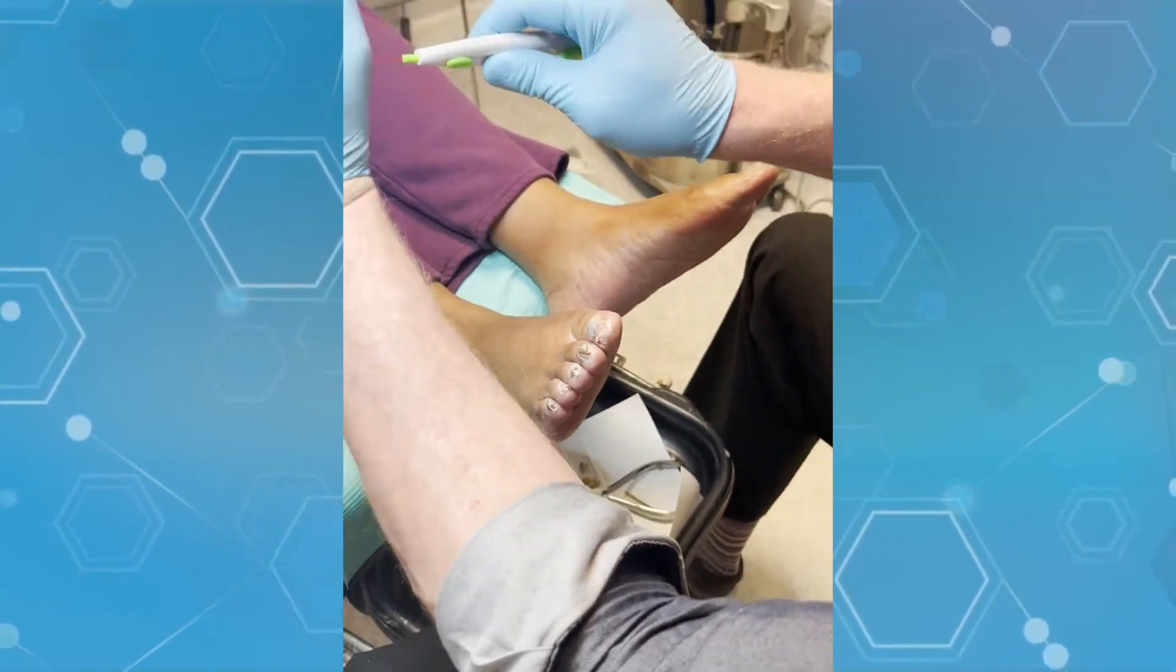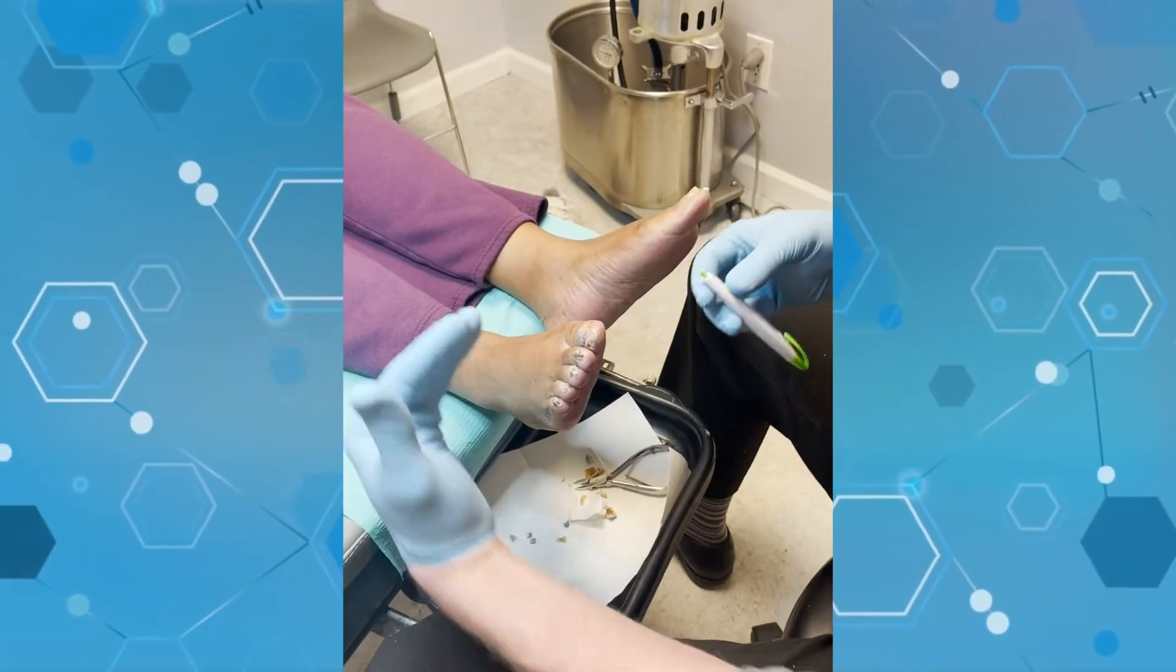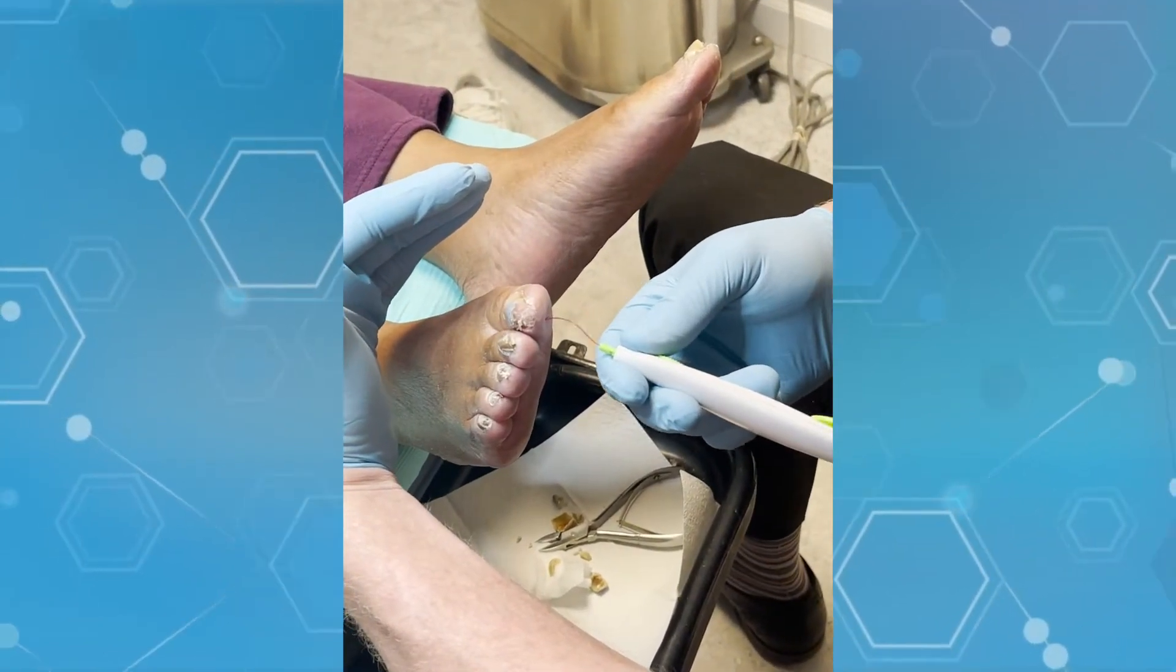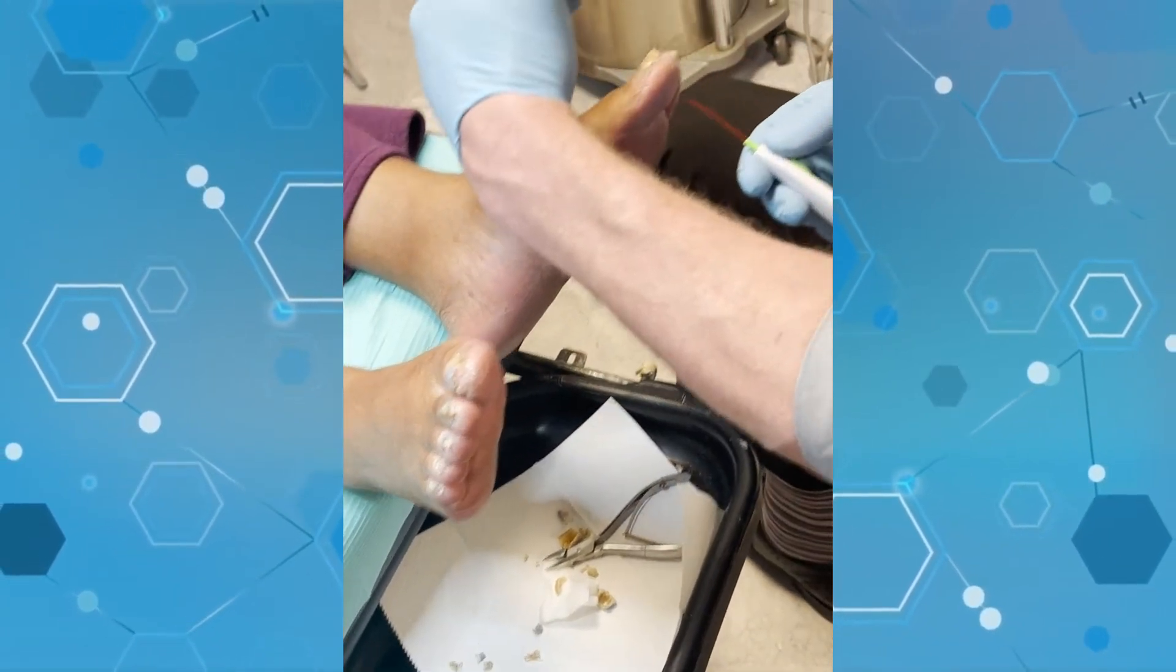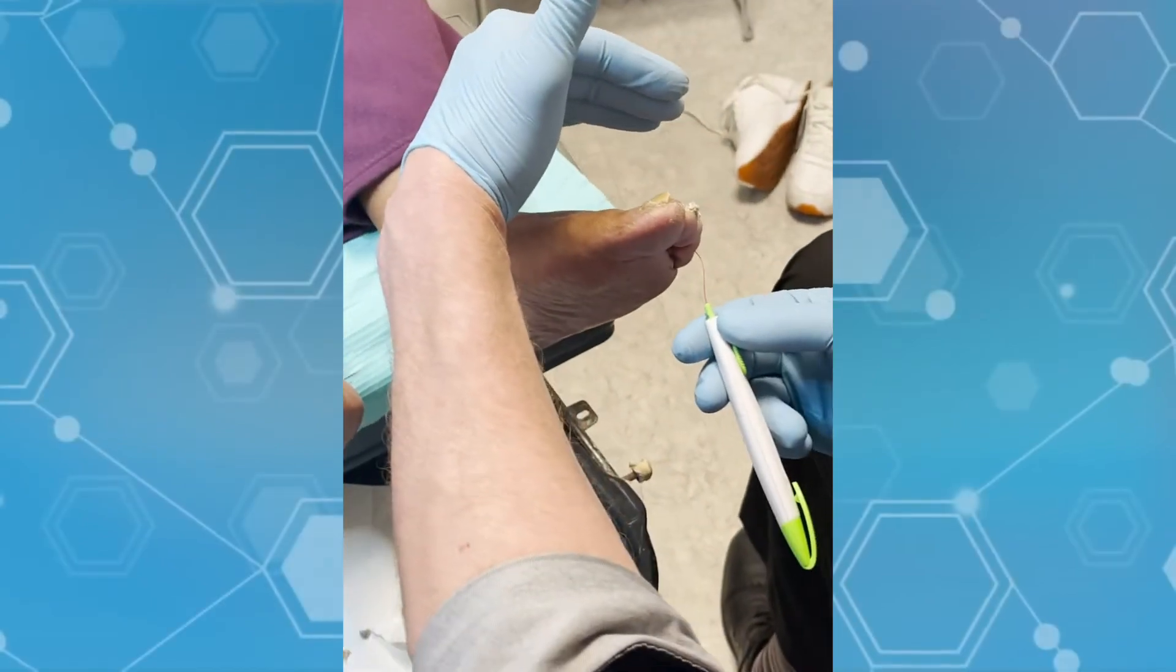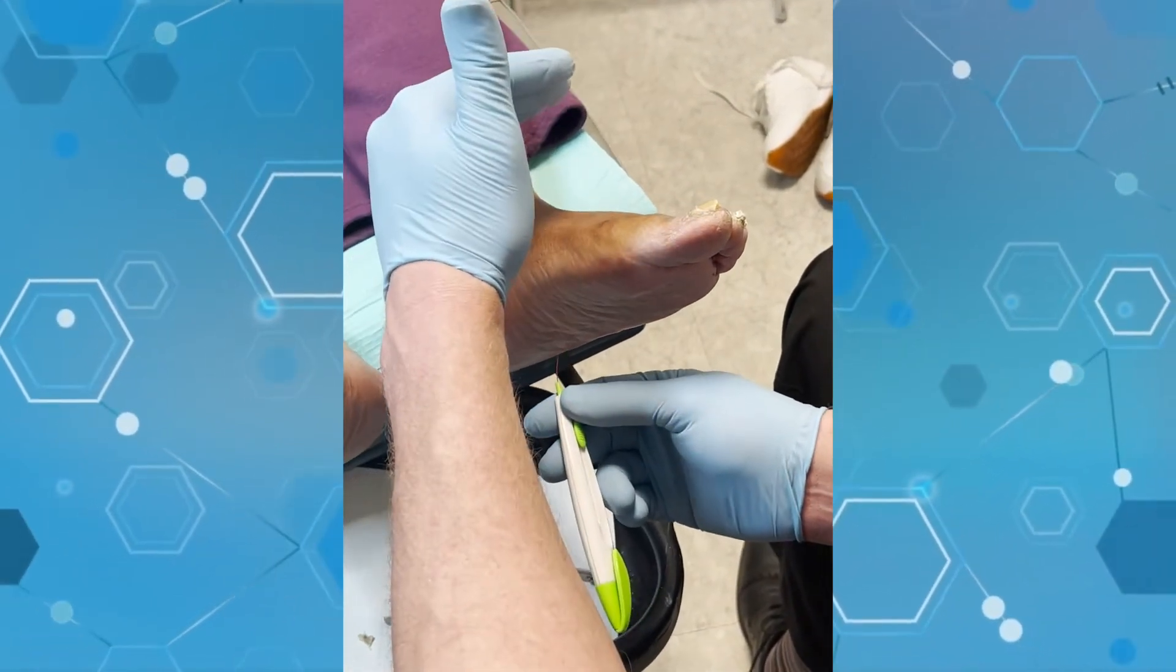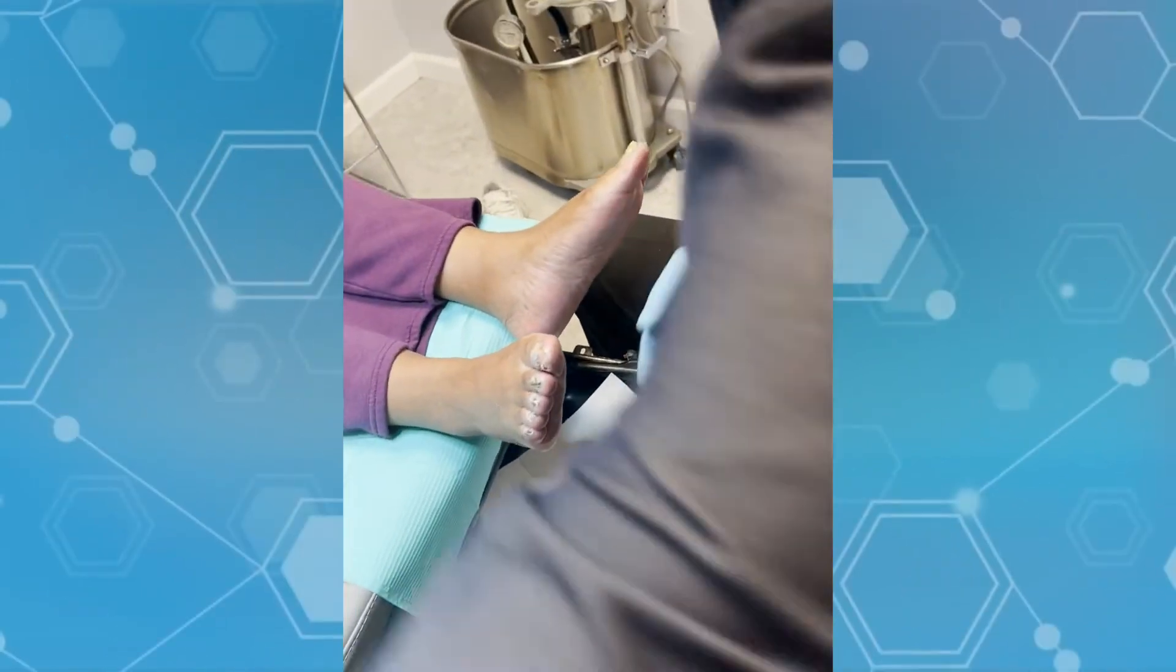Here at this part of the examination, we're doing what is called the Semmes-Weinstein monofilament test. We're using the Semmes-Weinstein monofilament - we have a 10-gram monofilament for this one. Gerilyn, would you like to tell us what this is for? Yes, it's an objective test. It's a simple instrument that's used to touch the foot. It's used in the screening for diabetic foot loss of protective sensation.